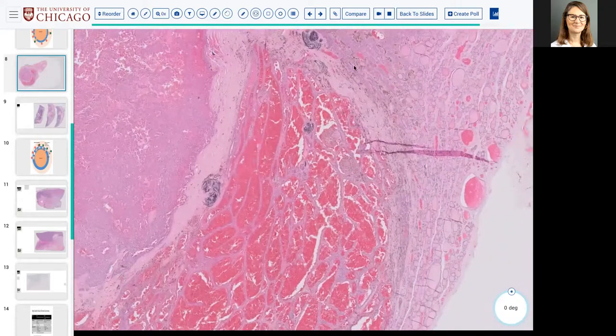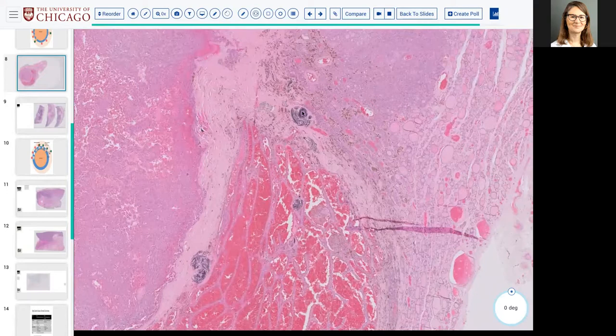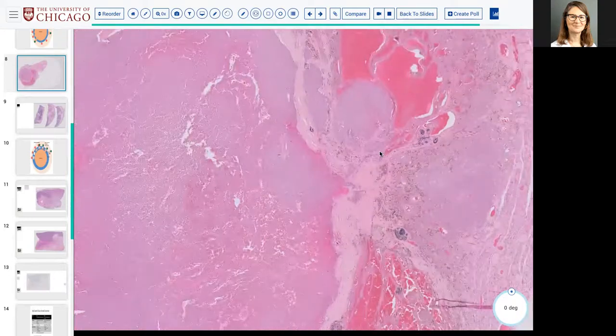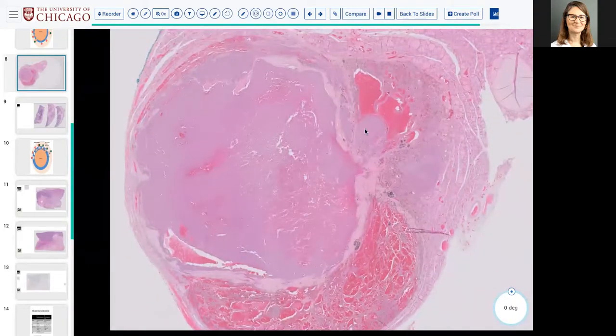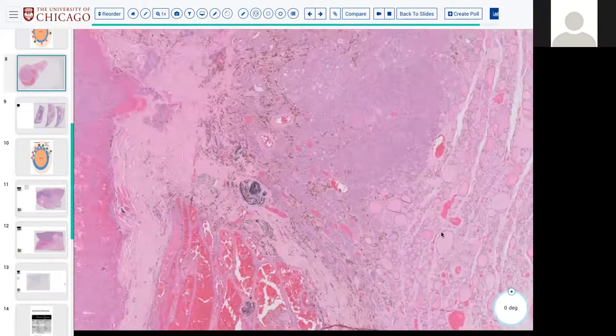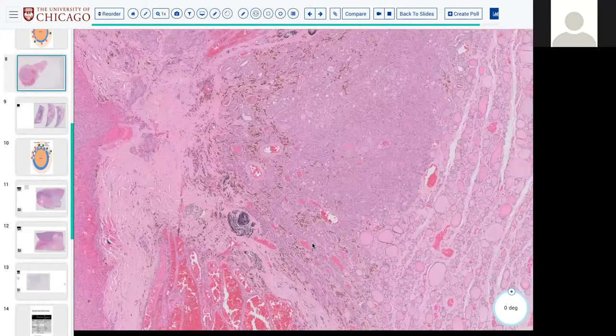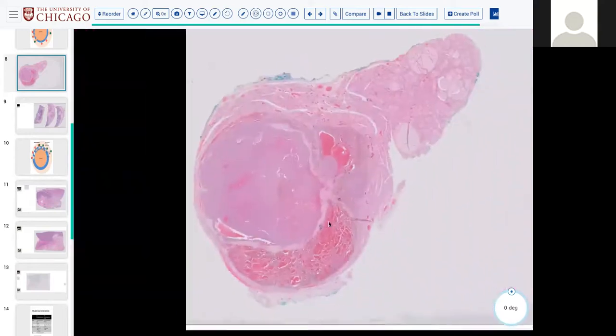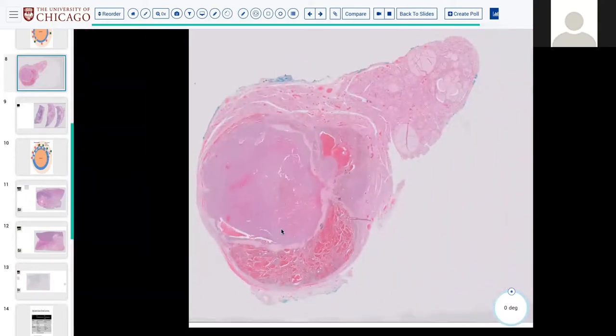That's fine. So then how do you interpret the fibrosis, hemosiderin? Is this invading through a capsule, or is this FNA infarction? Yeah, I guess it probably is more FNA infarction, because this can happen where you get this scar, so it looks like it's invading through a capsule. But yeah, I guess there's a lot of hemosiderin, which makes me think it's more due to FNA infarction than actual capsular invasion.